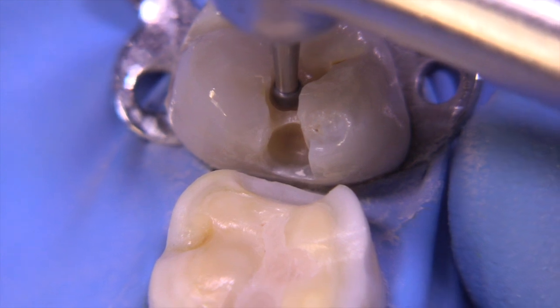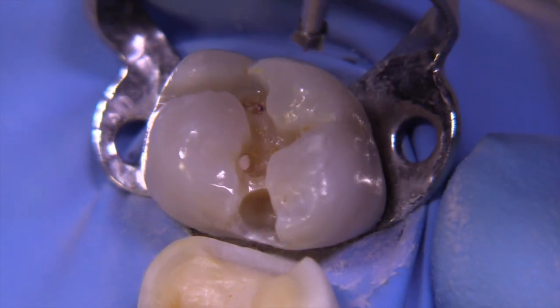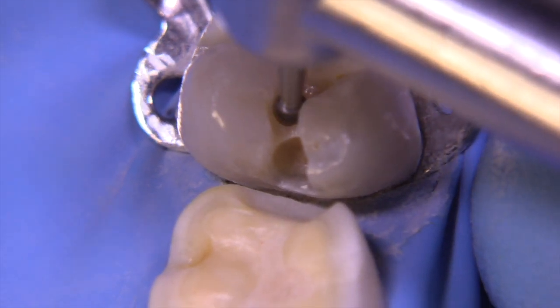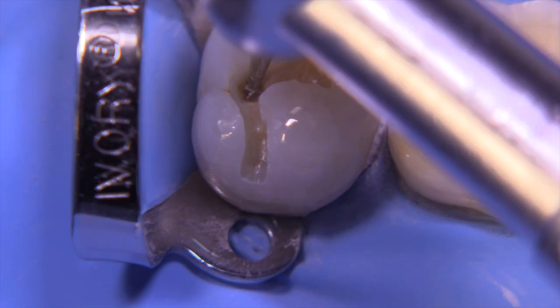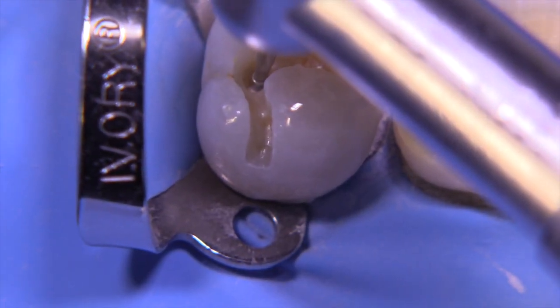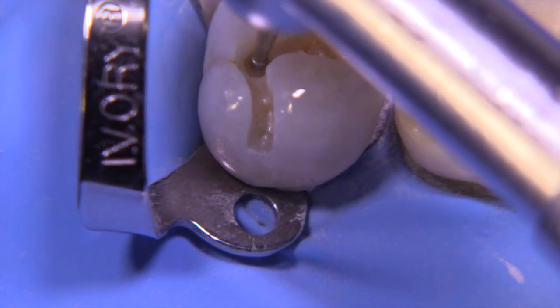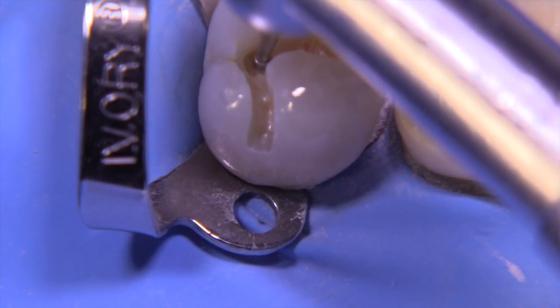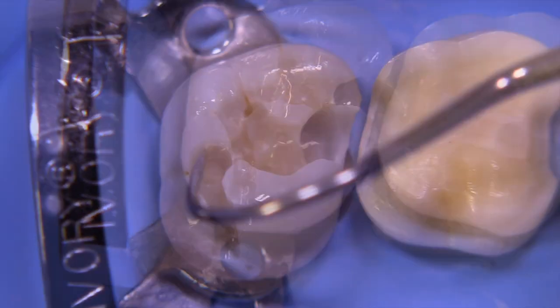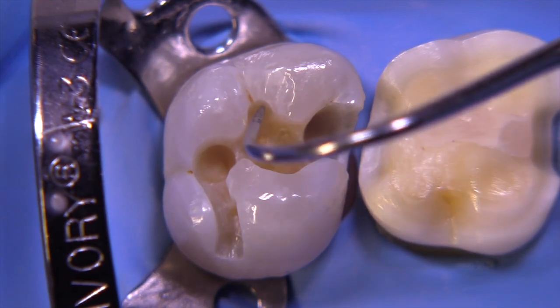The bigger burrs are more conservative in many respects because it takes a lot more force to push them too deep. Look at the amount of caries underneath the mesial lingual — I have no one to blame here because I put the caries in this tooth. This was all artificially generated using our turmeric, cayenne, and flowable composite recipe as we've done in past videos. It's fun to do, though, and you can see we've opened this up quite a bit.